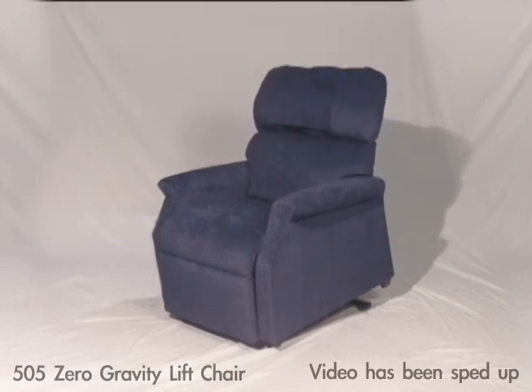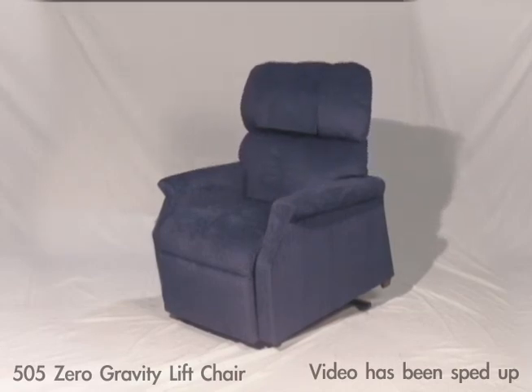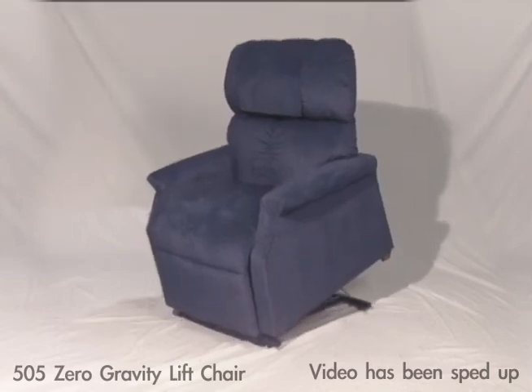You can see that the leg rest and back move independently, giving you so many different options for seating comfort.